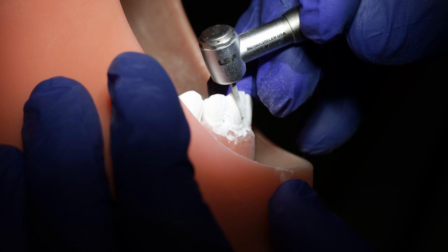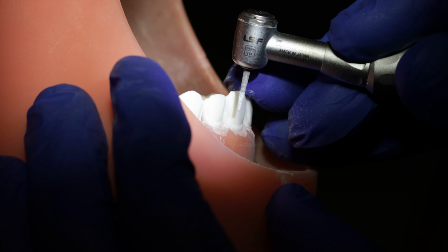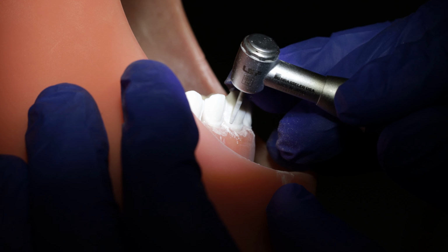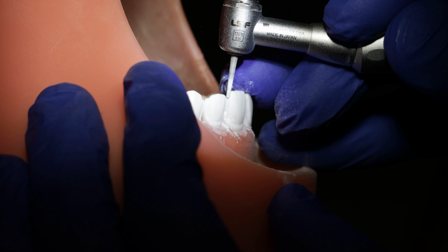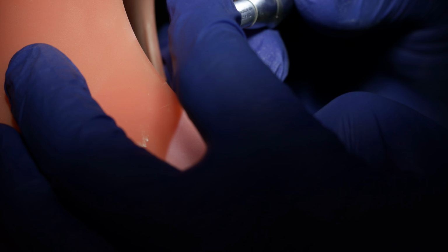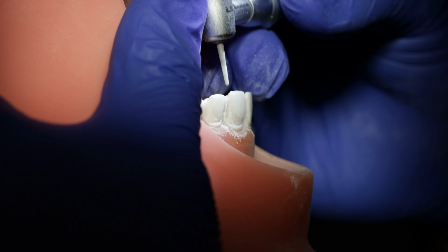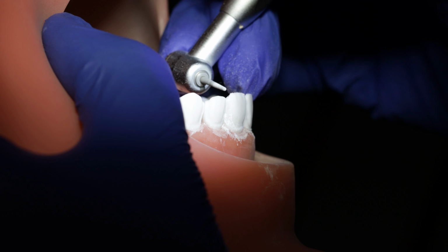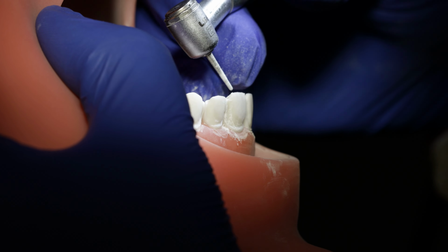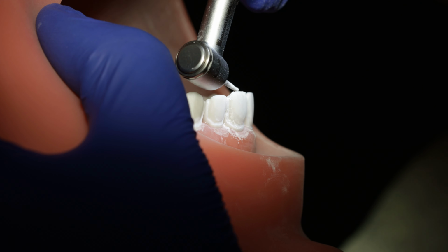I know what you're thinking, like, why do we even need this bump incisally, right? Why don't we just go flush, and we're already going lingual with the reduction? Well, when you're thinking of a veneer, it's essentially a shell that you're putting on top of it. And having this protrusion gives the shell something to grab onto, so there's a little bit more resistance, say, if we were to apply pressure mesially or distally. There's a wall of tooth structure to keep it in place.